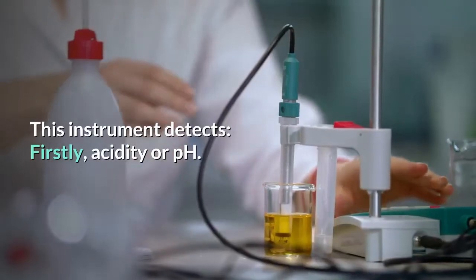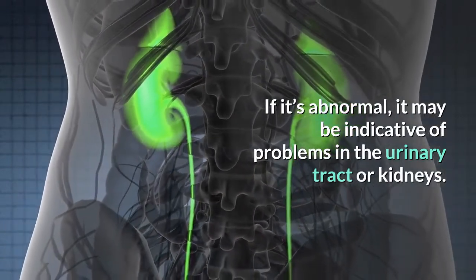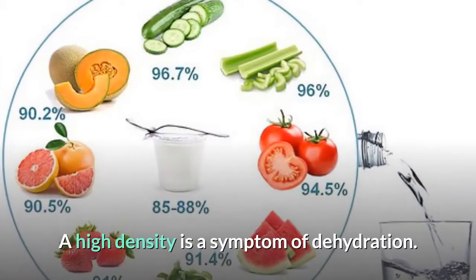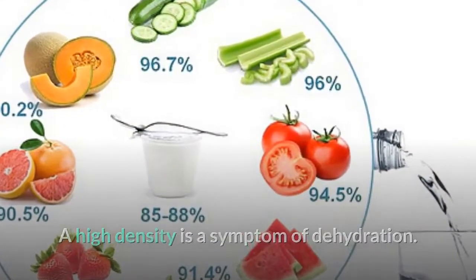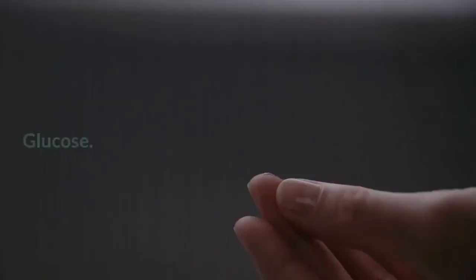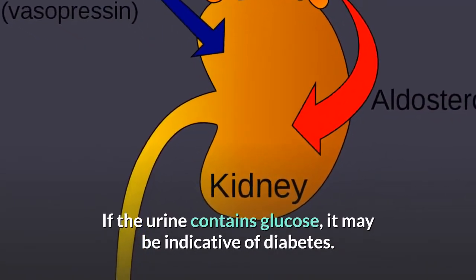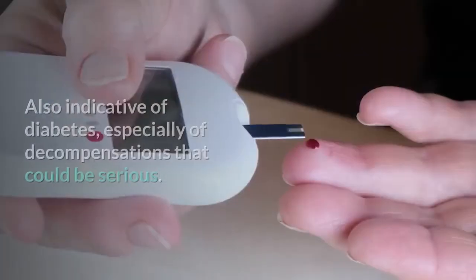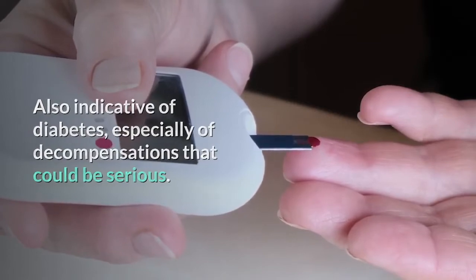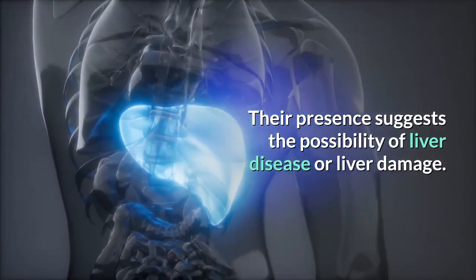This instrument detects, firstly, acidity or pH. If it's abnormal, it may be indicative of problems in the urinary tract or kidneys. Density. A high density is a symptom of dehydration. Protein. Elevated protein is indicative of kidney problems. Glucose. If the urine contains glucose, it may be indicative of diabetes. Ketone bodies. Also indicative of diabetes, especially of decompensations that could be serious. Bilirubin. Their presence suggests the possibility of liver disease or liver damage.